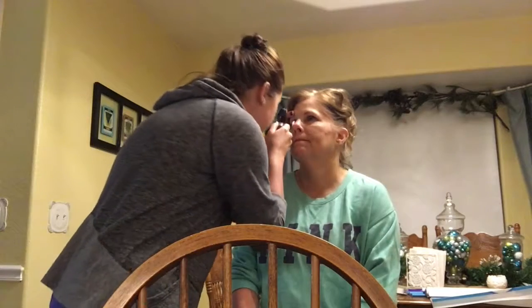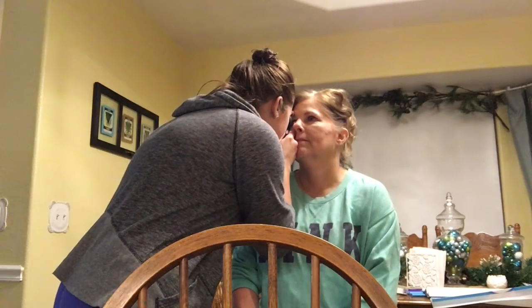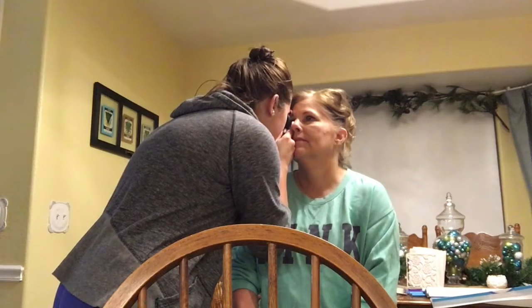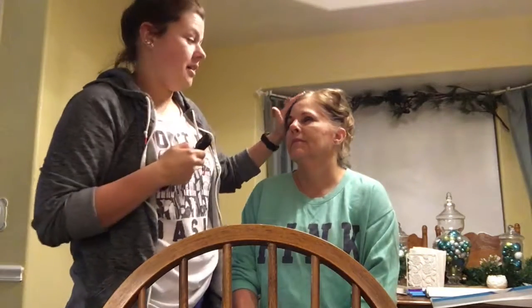So I'm going to ask the patient to look at the top of my ear, and I'm just going to look into your eye. Yep, and I see the optic disc. It kind of like reflects the light back at you, and the fovea is like a dark spot on the back of the eye.